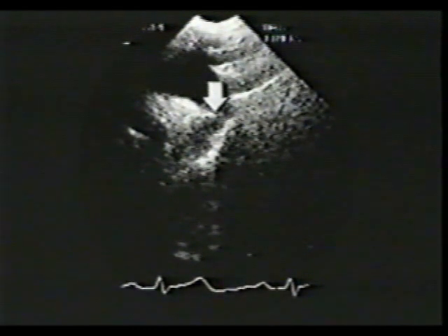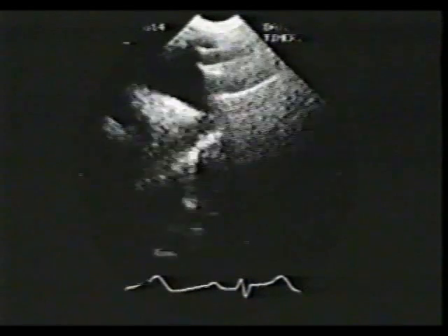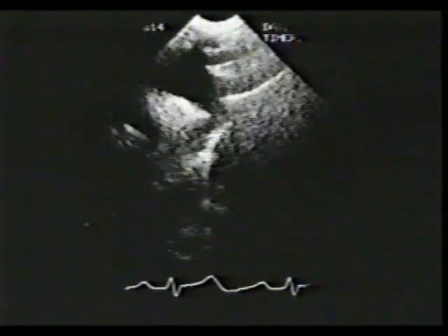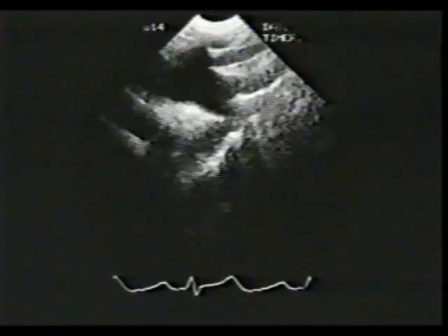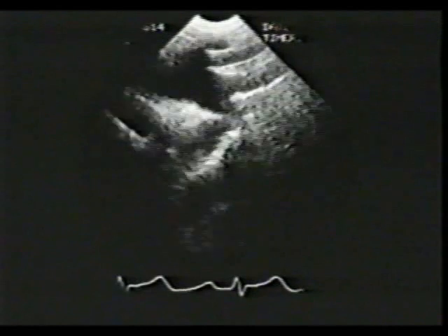Note the coarct segment is shown with a shelf-like deformity. Here is a dilated left subclavian artery. Dilated arch of the aorta is also seen. We'll see this in real time now. Note the post-stenotic dilatation of the descending thoracic aorta also.